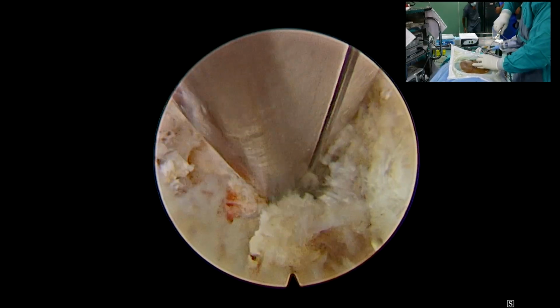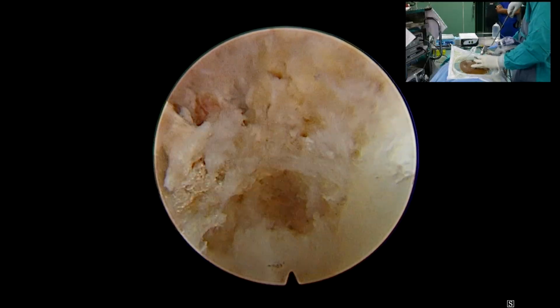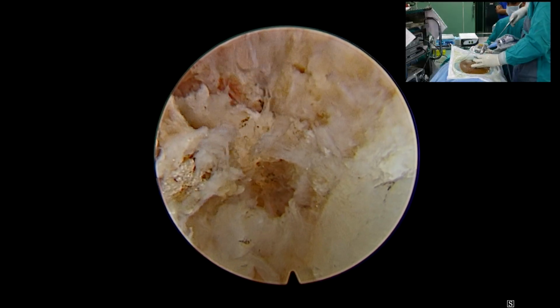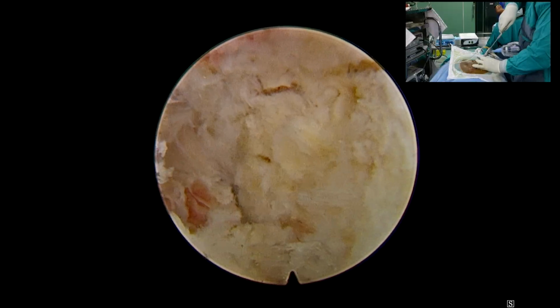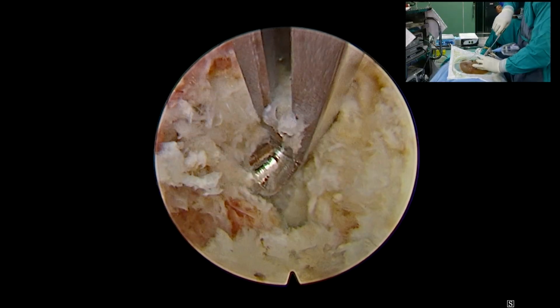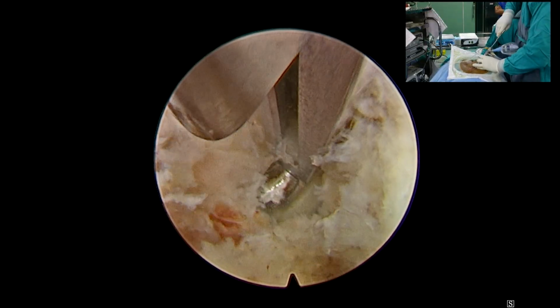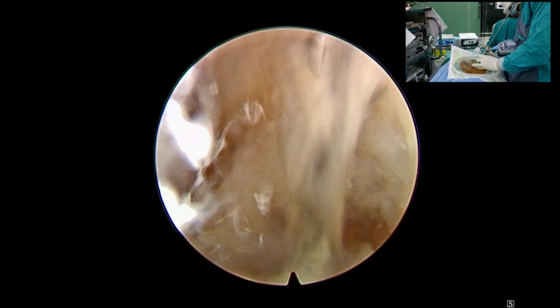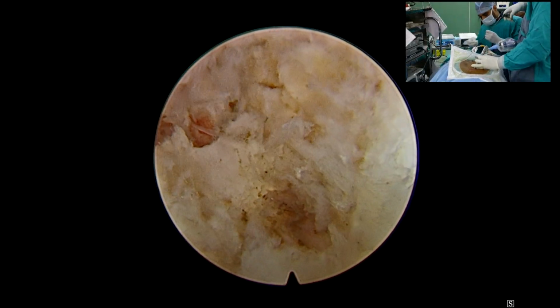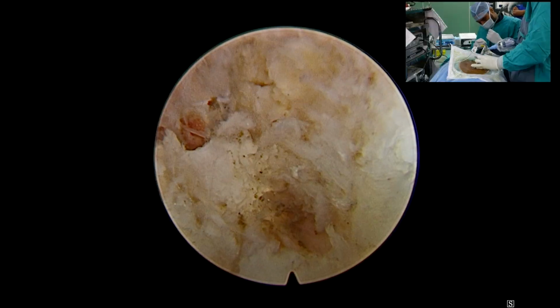Are you using a 2 mm or 3 mm punch, Dr. Shubhendu? I was saying there are 2 mm, 3 mm and 4 mm Kerrison punches. We use 2 for nibbling the bone and 3 for punching and removing the bone.